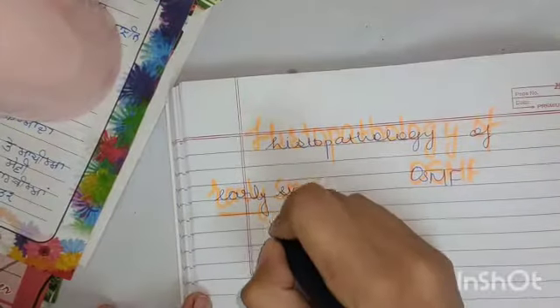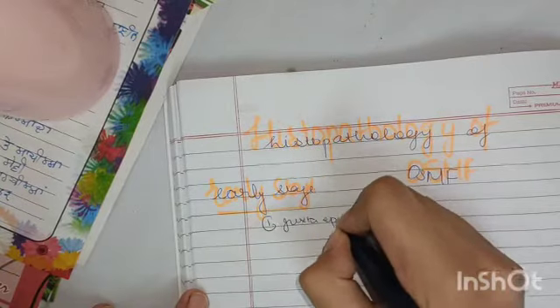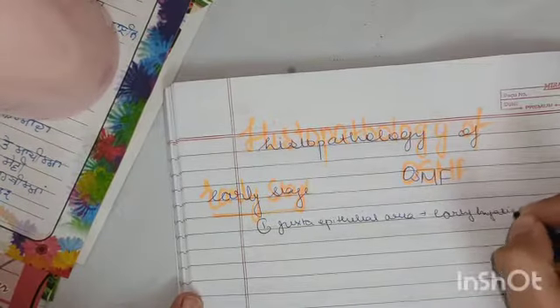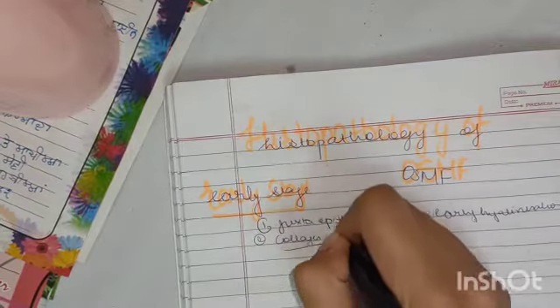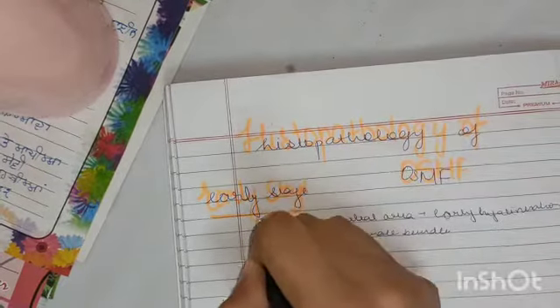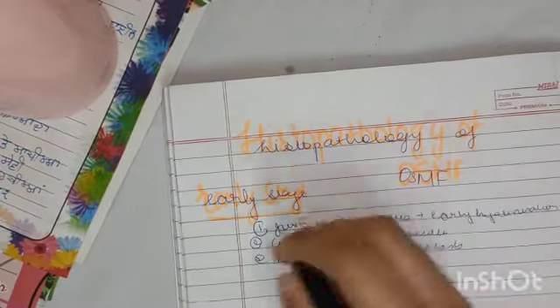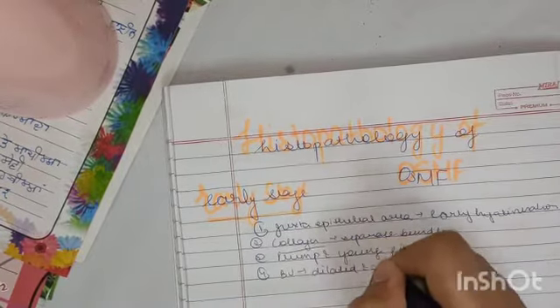Now coming on to the early stage, in this what we see is that the juxtaepithelial area shows early hyalinization. Then we see that the collagen is seen in separate bundles. There are plump and young fibroblasts. The blood vessels are dilated and congested.